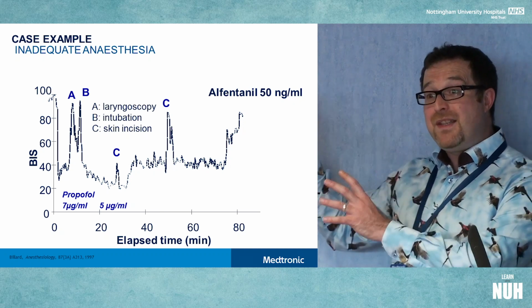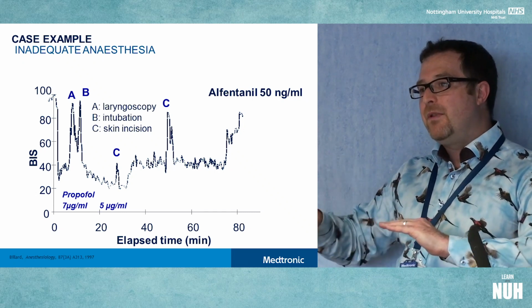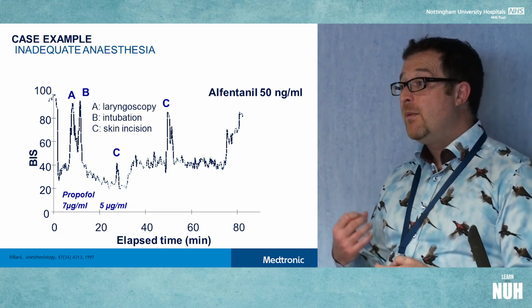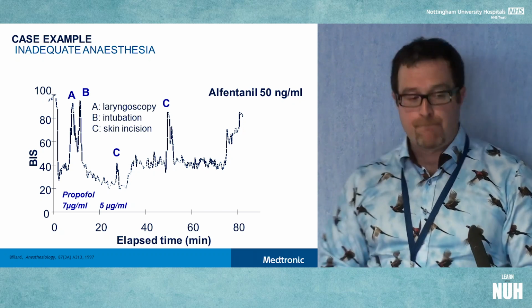So hopefully you'll never see anything that dramatic, but it raises the point that the lower the BIS, the more stable it tends to be to maintain the patient, rather than running a BIS in the mid to high 50s, where you might need more analgesia, you might need to look at that overall balance.